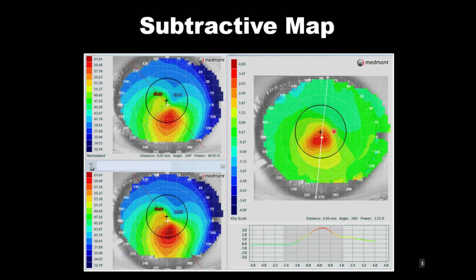So clearly the cone is progressing. We see the area that it's popping out between those two visits with the patient. This is probably a patient that should go off for cross-linking to get that eye under control and stop the cornea from getting any worse, and possibly reducing the patient's quality of vision even more and increasing their chances of needing a transplant somewhere down the road.